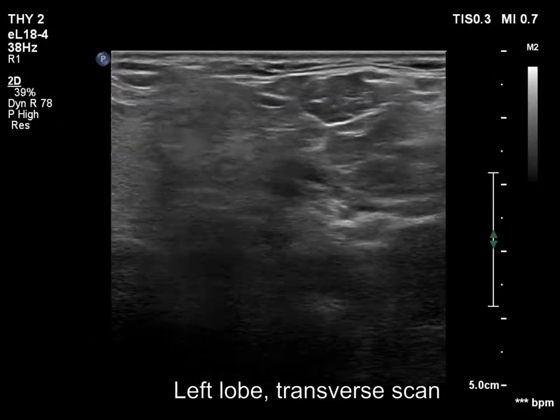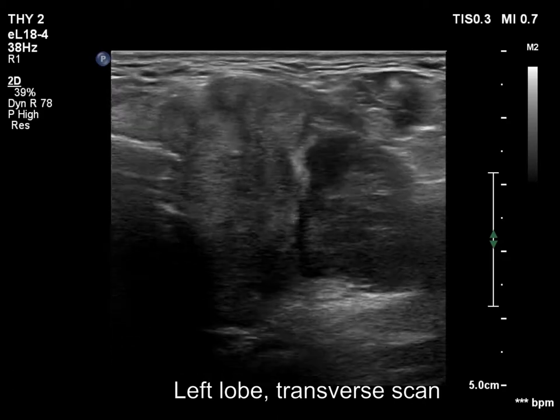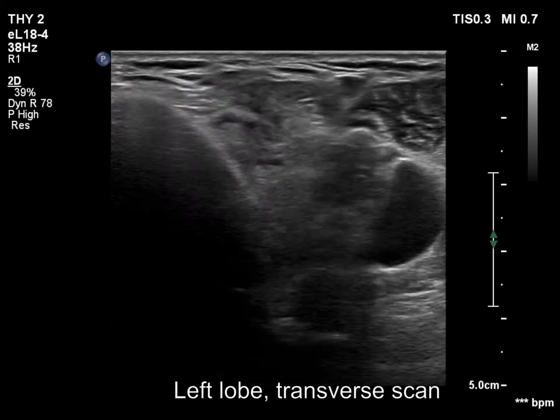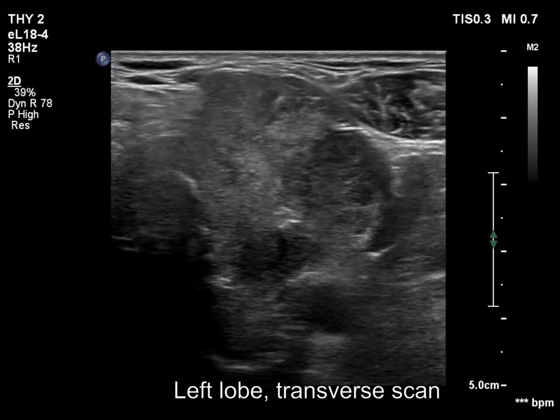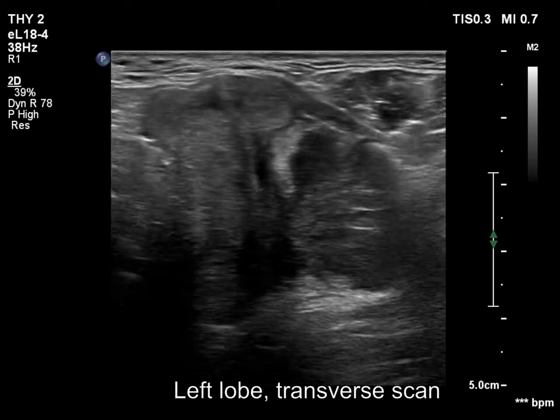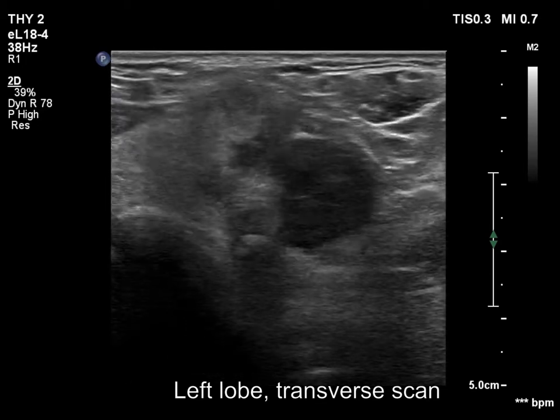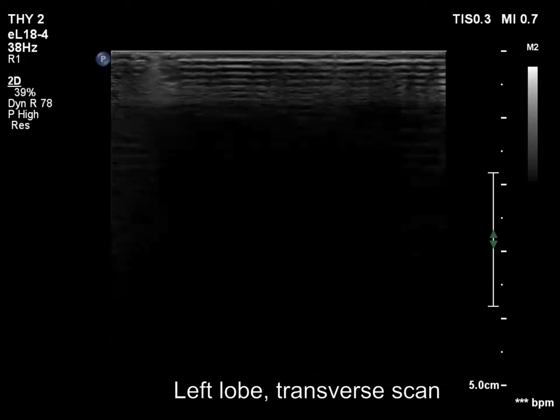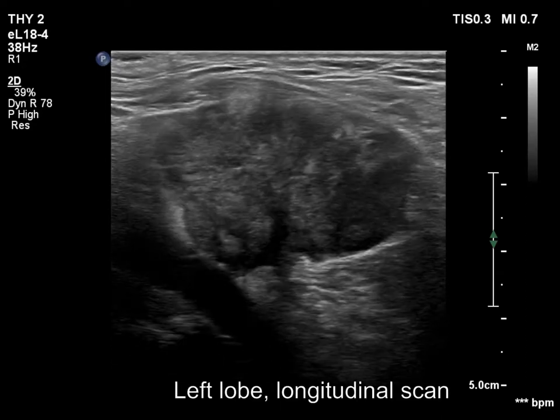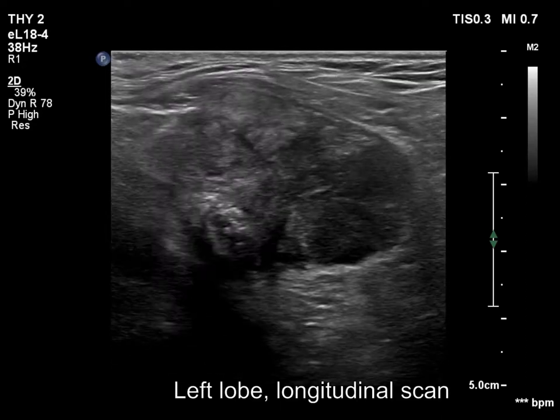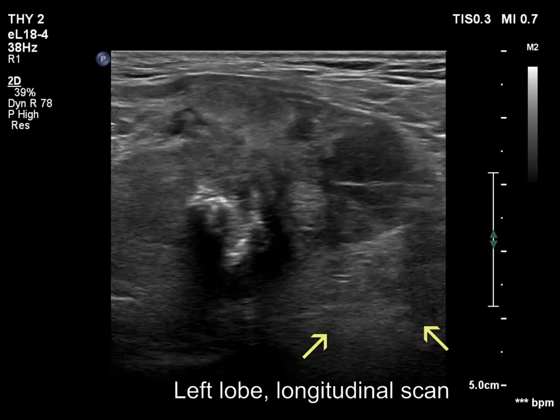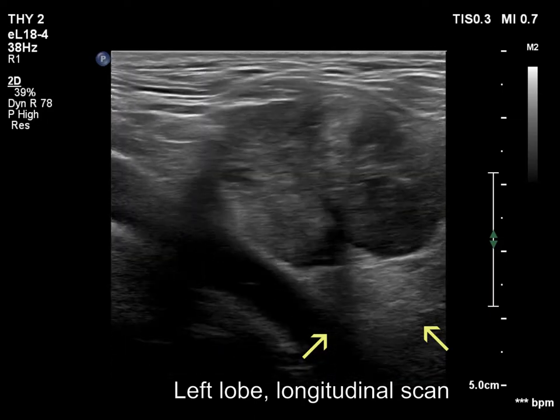A large tumor occupies almost the entire left lobe. The tumor is heterogeneous, with echonormal and deeply and moderately hypoechoic areas. The latter seem to prevail. Normal thyroid tissue can be found in the dorsal part.